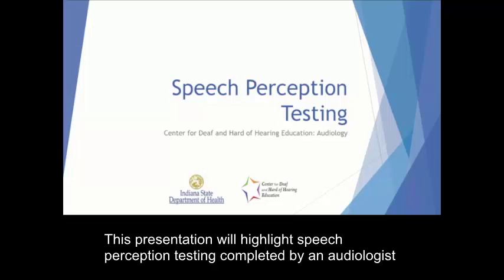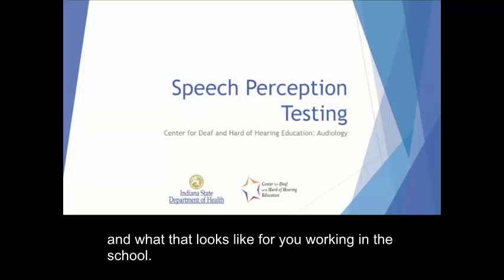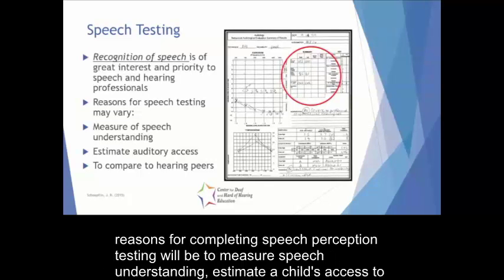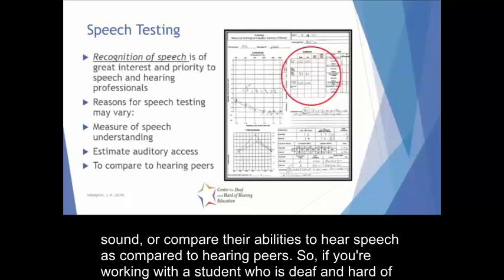This presentation will highlight speech perception testing completed by an audiologist and what that looks like for you working in the school. The recognition of speech is obviously of great interest and priority to speech and hearing professionals. Reasons for completing speech perception testing will be to measure speech understanding, estimate a child's access to sound, or compare their abilities to hear speech as compared to hearing peers.